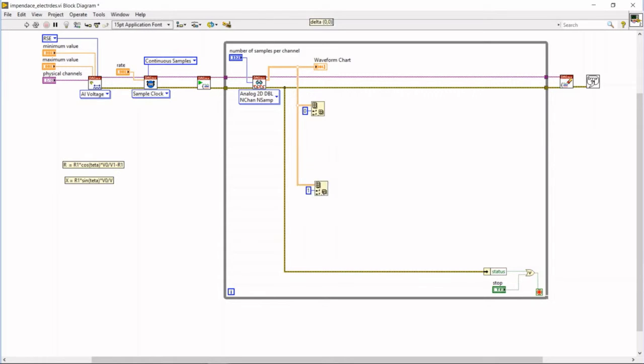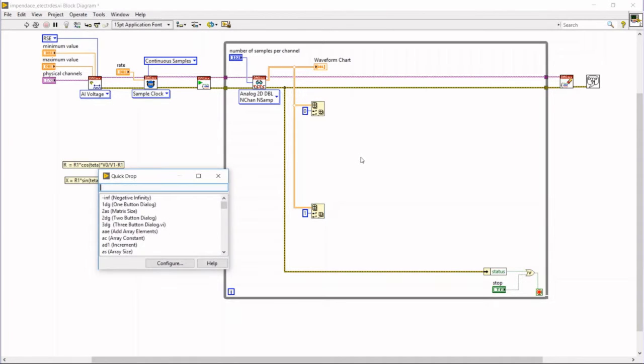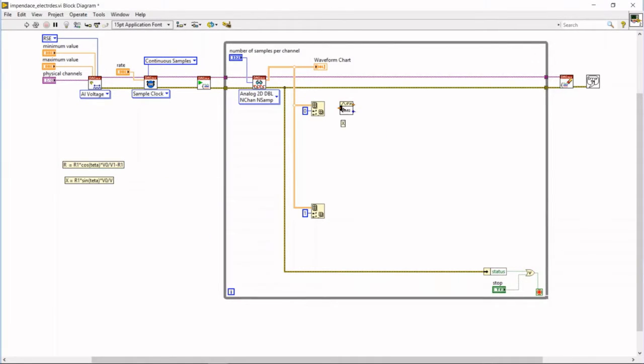I'm going to set this a little bit lower so we can put our code here. Okay, because we get VA as a number of samples, we're going to use the root mean square function to calculate the mean value of our signal. So RMS.vi, and I'm going to place that here and also here. Okay.